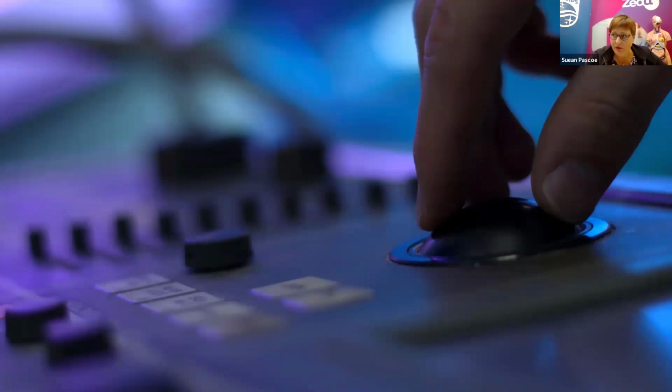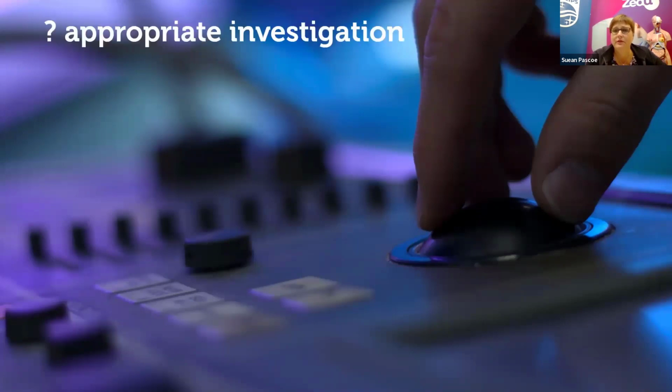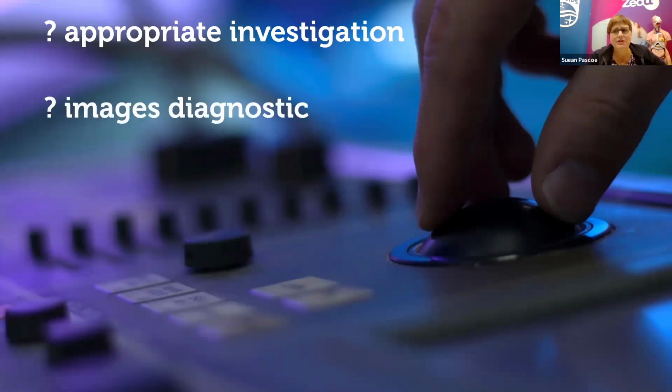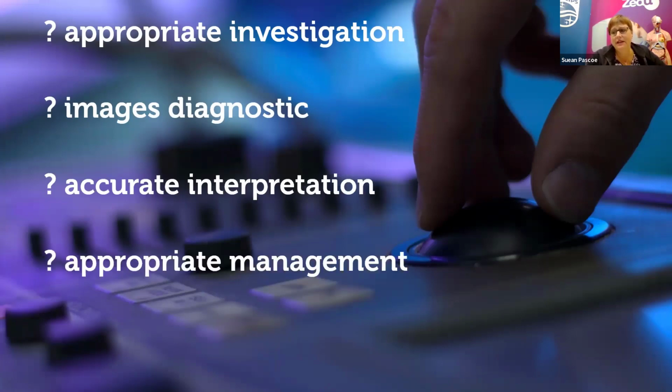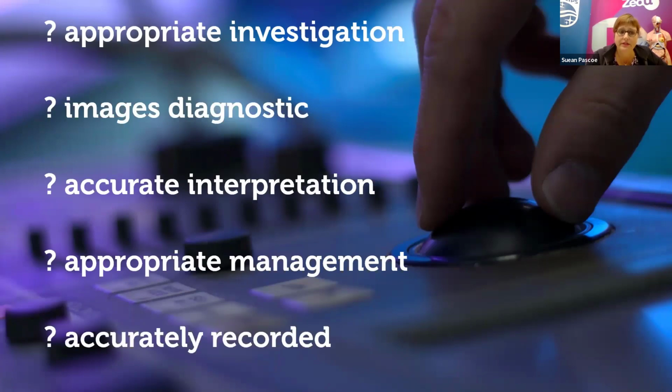So when I'm looking at the image review, first question I want to get across is, have we done an appropriate investigation? Are the images diagnostic? Have you accurately interpreted the images? And then, far be it for me to say, but have you acted on those images in the correct way and managed the patient? And have you accurately recorded the images?